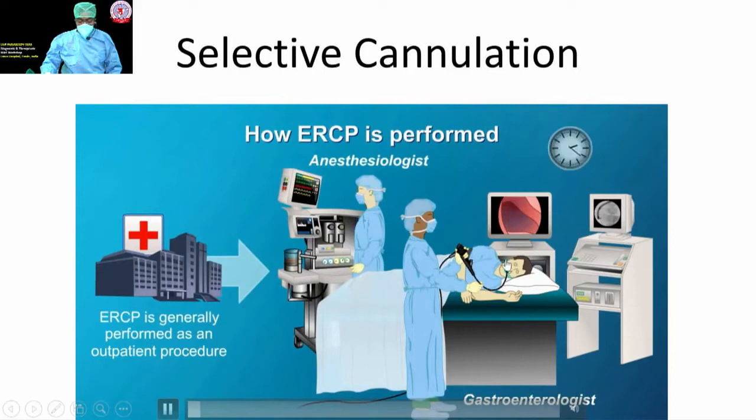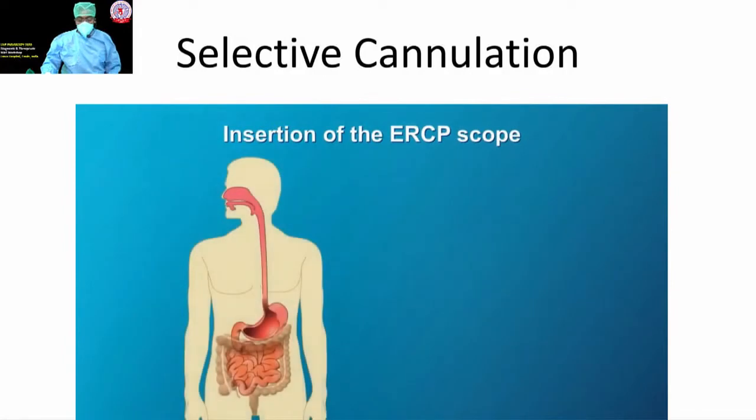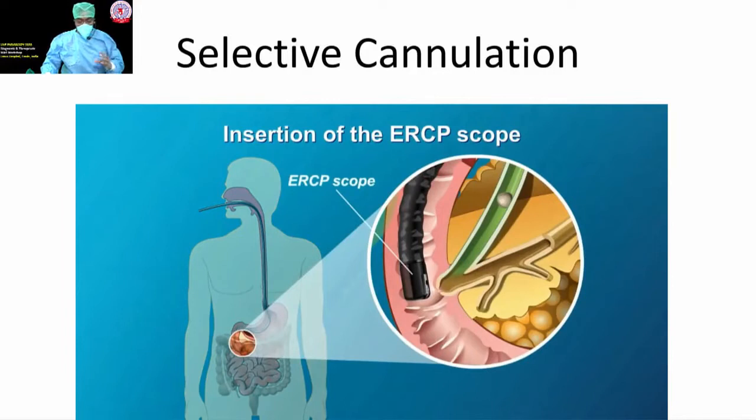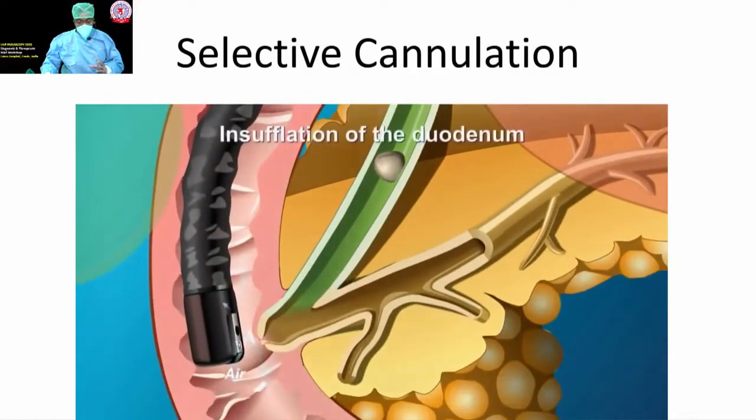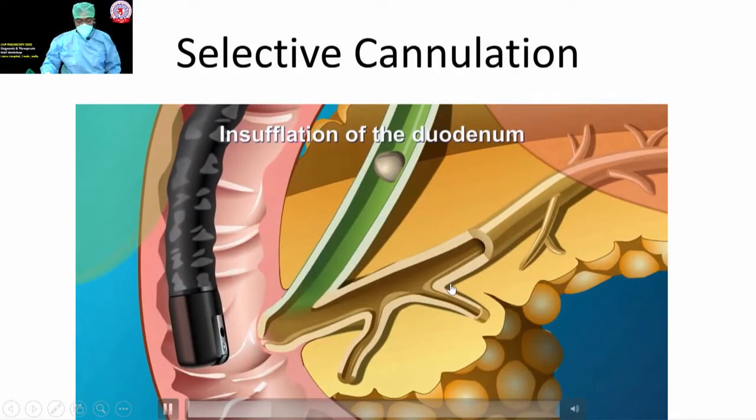Sometimes the initial intubation is preferably done with the patient in the left lateral position, or what we call a semi-prone position. Because here it is a side viewing scope, the view as you travel down through the esophagus and through the stomach is not optimum. But you can go through the D1, D2 junctions. You have to do some maneuvers and dock right in front of the ampulla. We are going to show all these things live.